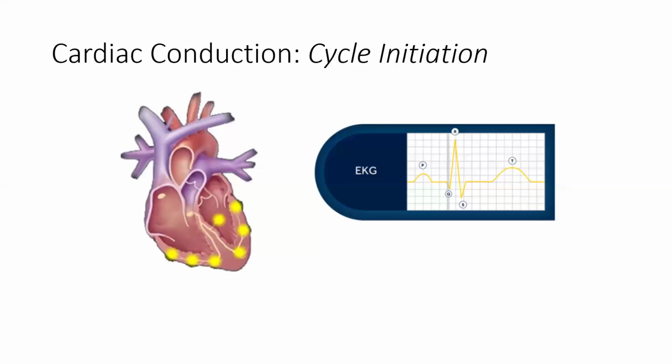After leaving the left and right bundle branches, the impulse passes through the Purkinje fibers, which are interlacing fibers of modified cardiac muscle. On the ECG, this is represented as a Q wave, as you can see where the gray mark is. And of course, after that, the impulse passes quickly through the bundle of His, the left and the right bundle branches, and the Purkinje fibers, leading to the depolarization and contraction of the ventricles.